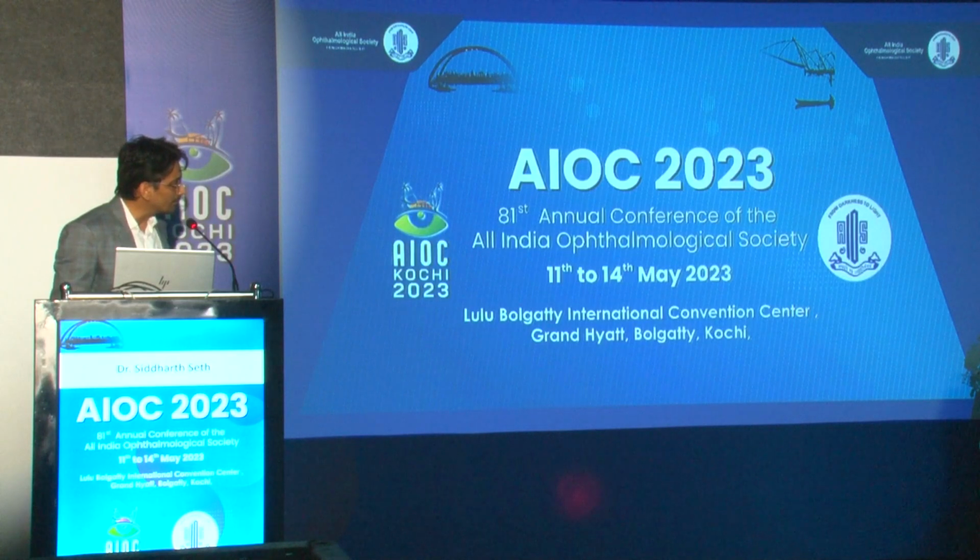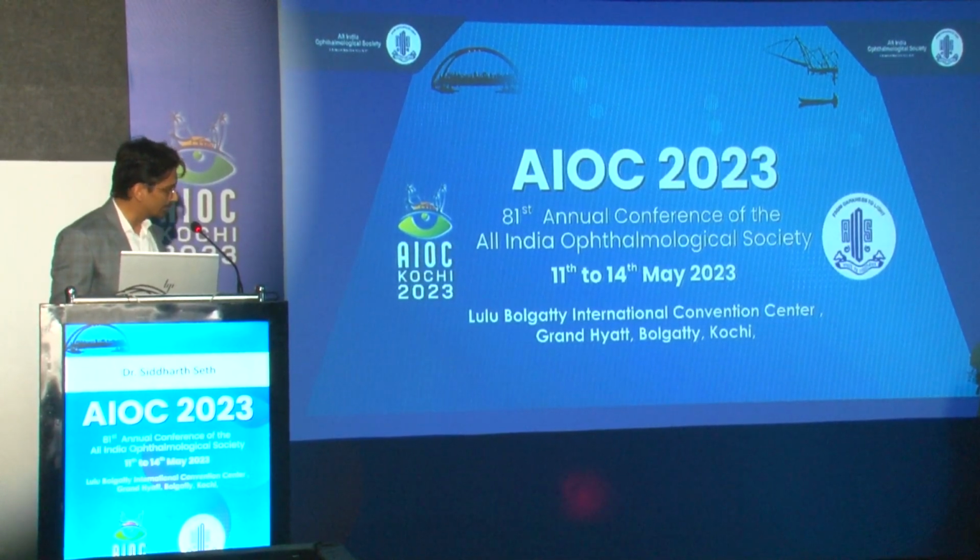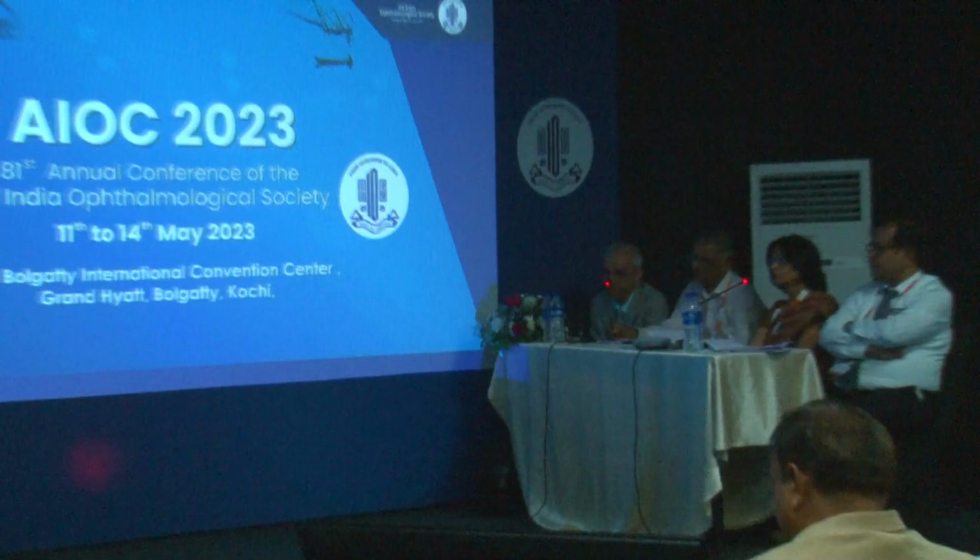What was your limit for toric lenses? The minimum astigmatism at which you started with a toric? 0.8. 0.8. Okay.